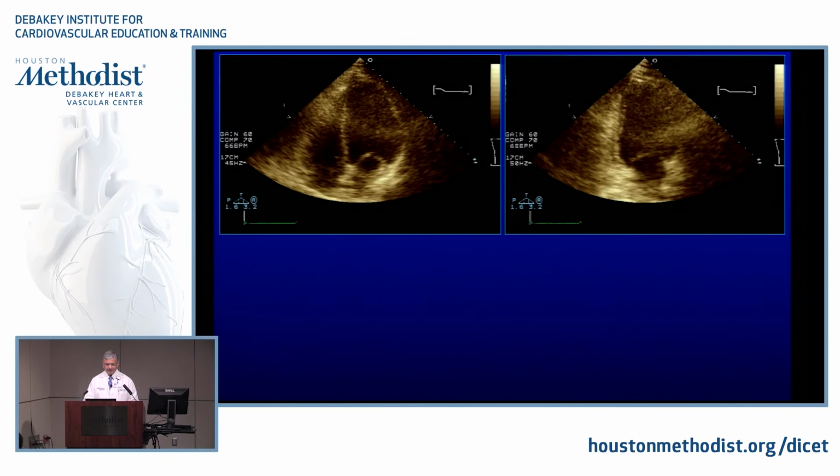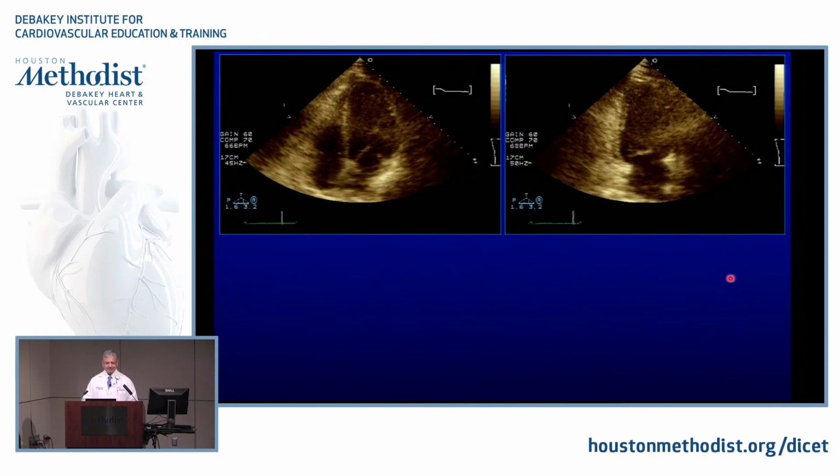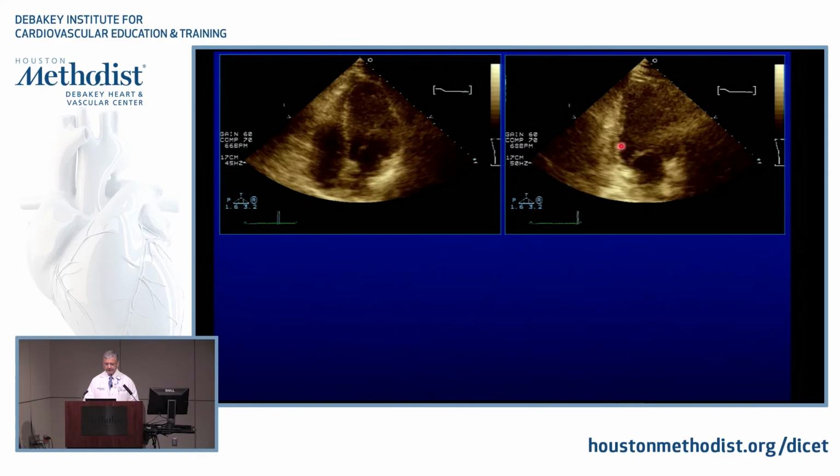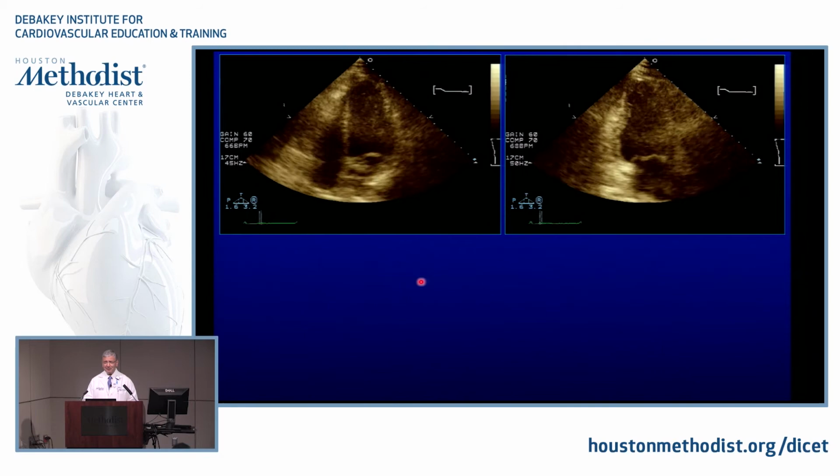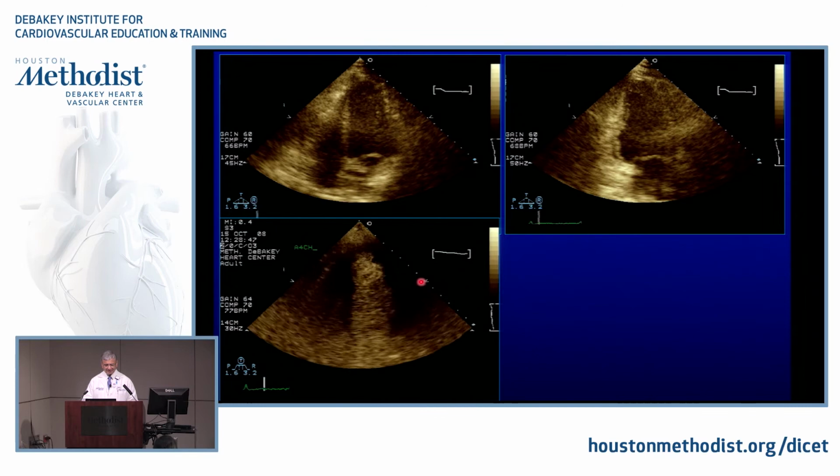All right, I want you to help me out with these guys here. This is a patient. I want your interpretation. Inferior wall is akinetic. How about the other areas? Okay to you? Slightly hypo. Okay. You want to know what it looks like?